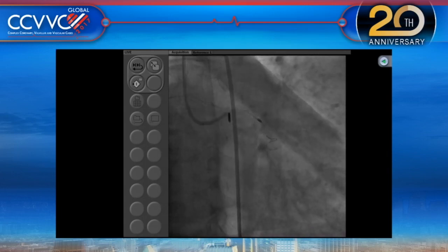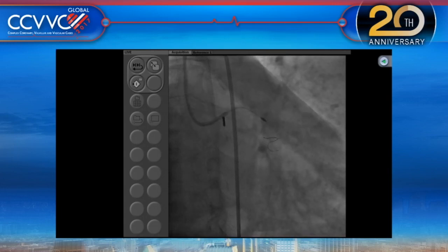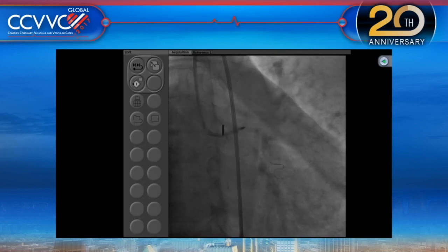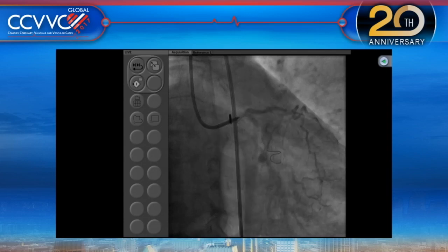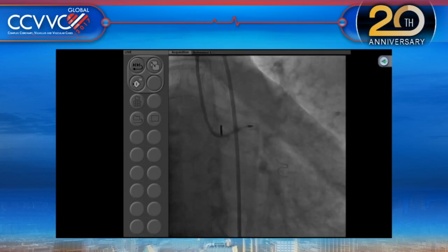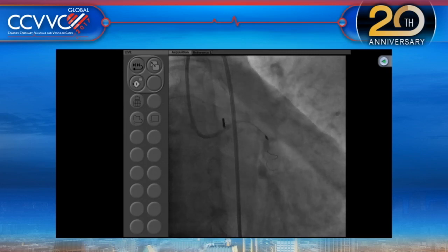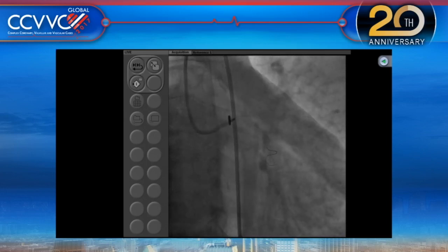We did. Yeah, it's so tortuous that sometimes you do have to spin. A lot of the CTO catheters, I notice, have to spin, especially if they're subtotally occluded and calcified. I'd be a little concerned about the second lesion because of its proximity to that sharp bend. If the RotaBlator jumps through there, I'm afraid it would dissect or perforate. So taking your time, going slowly would be essential. Dissect or perforate or even stall. If you hit it just right and get halfway through there and suddenly it decelerates, now you're stuck because you can't get it spun up again.